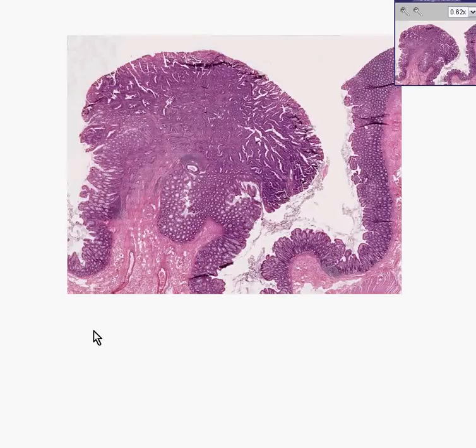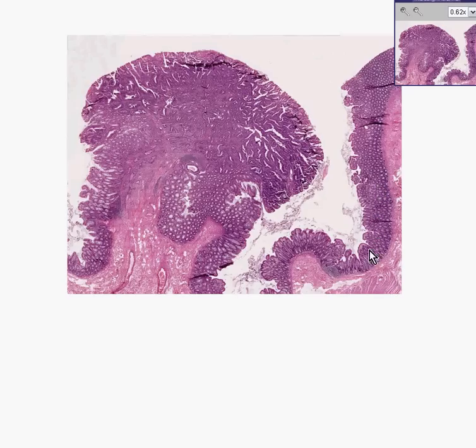Here is another colon tumor. Notice here is a normal mucosa. Here is a normal submucosa. Here is a normal mucosa traversing over a little submucosal hump.